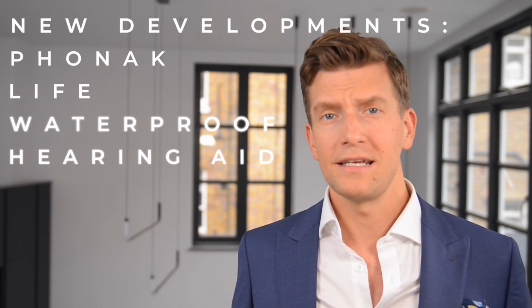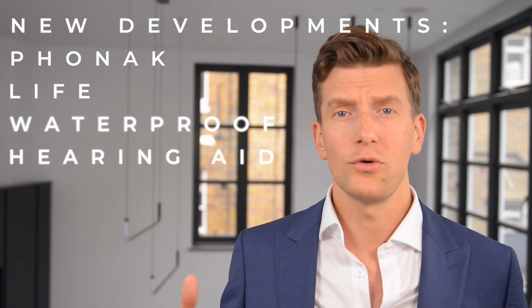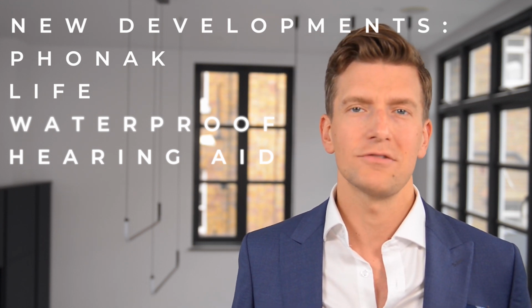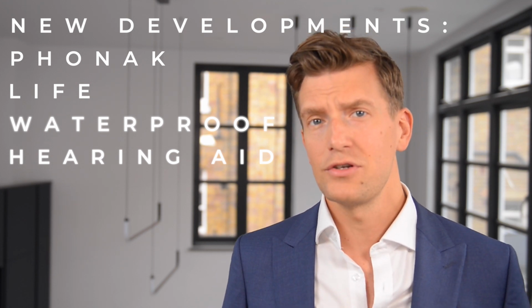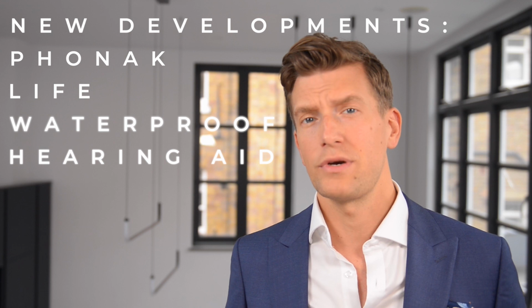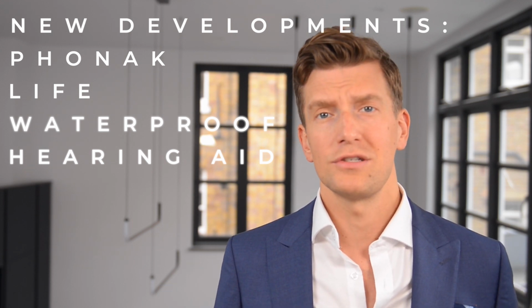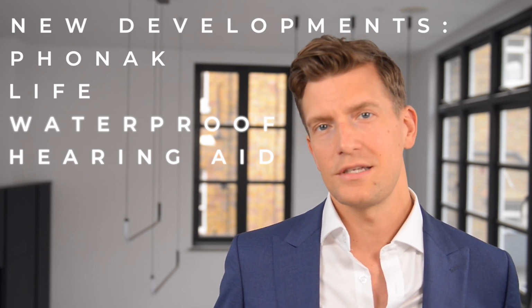It might just be a step change in terms of how they protect their hearing aids going forward, so we might see it on all of their future technology. However, if you're somebody whose hearing aids are repeatedly going away, they're breaking down, then this could be the hearing aid for you, because it will stop the hearing aids from breaking down due to sweat, due to dust ingression, and due to moisture ingression. So I'm hoping and thinking that we'll see a lot more robustness from these hearing aids.